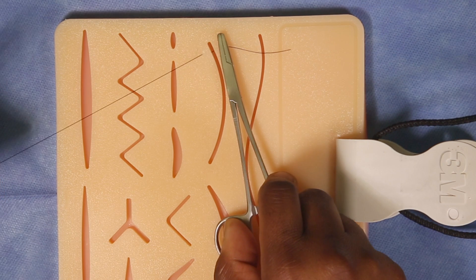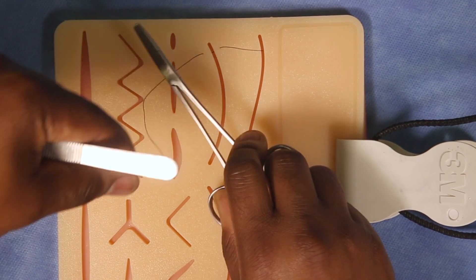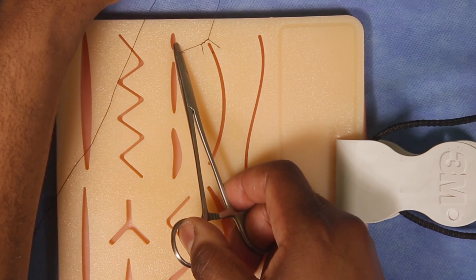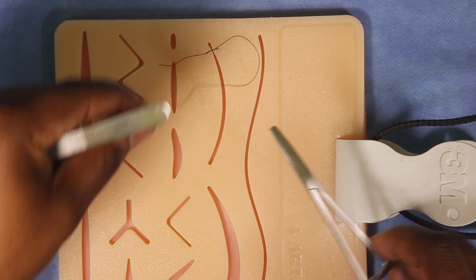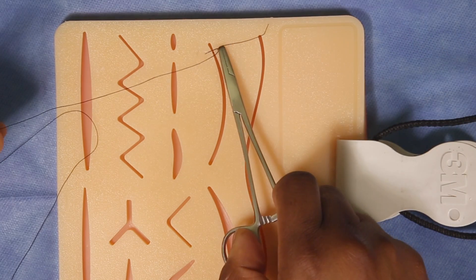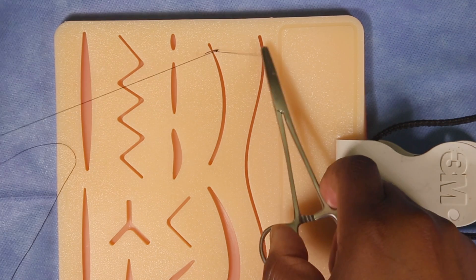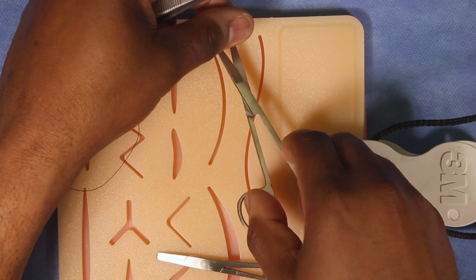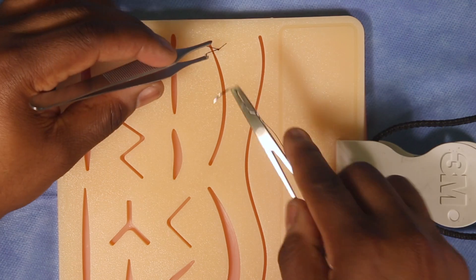For an instrument tie, you want to put your needle driver right in the middle, then wrap it around twice. Grab the edge and lay it down — you can see that's a nice little knot. If your hands are twisted, twist them the opposite direction so it lays down nicely. Right in the middle again, this time only wrap once. To lock the knot the third time, go to the opposite side, wrap it, and pull it through.